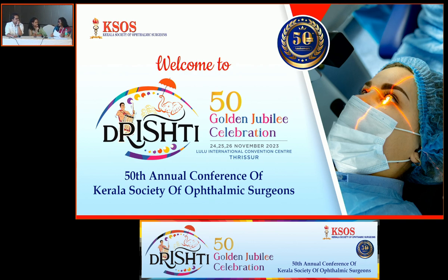How do you deal with the bleeding during the surgery? The problem I face now is that after phaco surgery the patients are usually very happy, but if you combine with this, the next day there is bleeding, and you have to prepare your patient and tell them it's not going to be that clear a vision. With just phaco you get a very clear vision the next day, but this hyphema takes some time, not in all patients, but some do have it. During the procedure, if you find bleeding, you can inject visco into that area. I just leave some visco there.